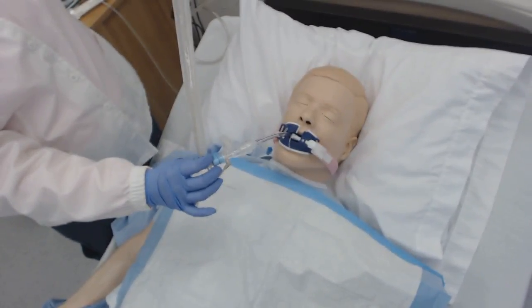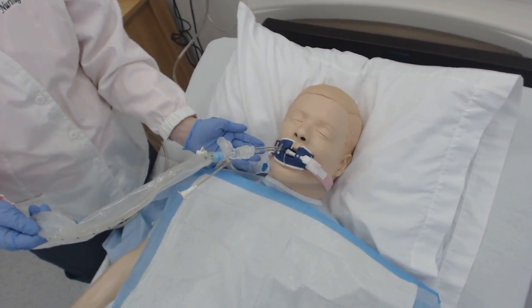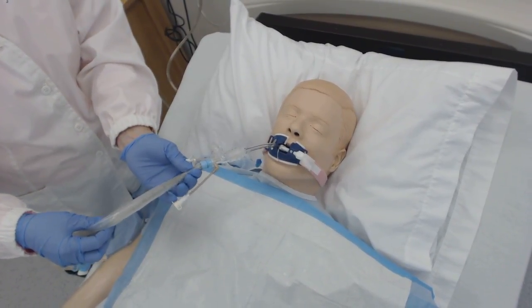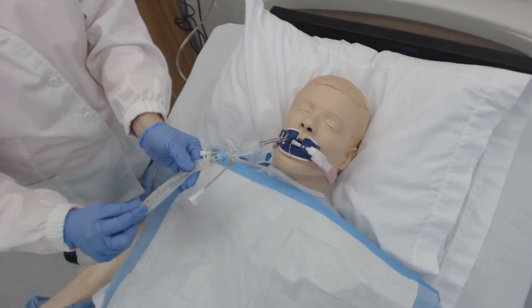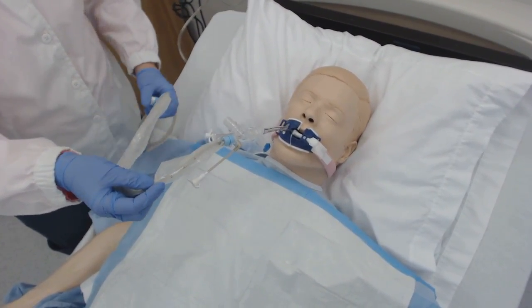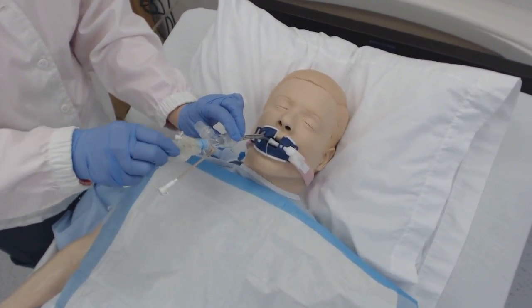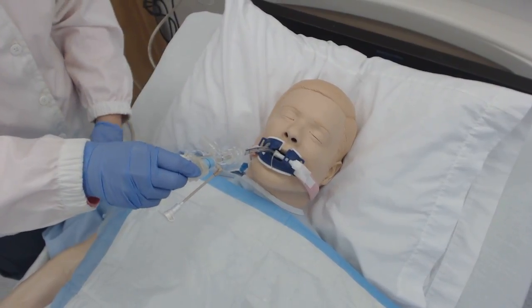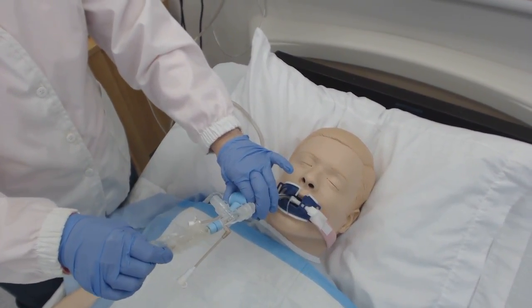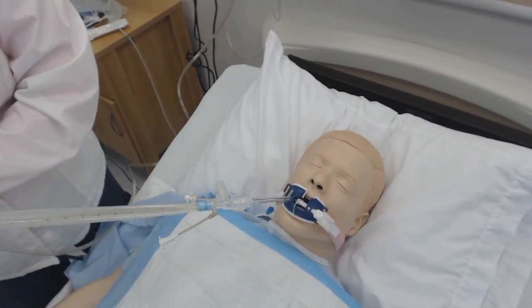Do you see how much longer this is than the trach? Because it has the whole oropharyngeal airway to go down before it can get to where it needs to be. There's actually writing on the side so you know how far down you're going. When you want to suction, you feed this down, the patient begins to cough, you press on the suction button, and then you pull this back.